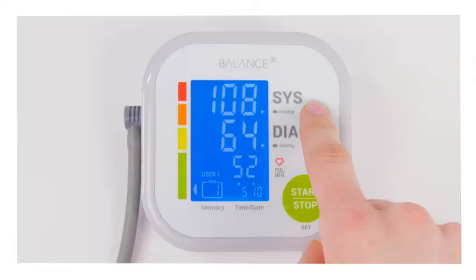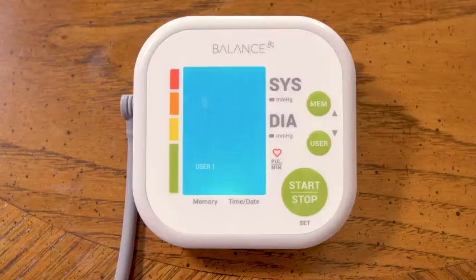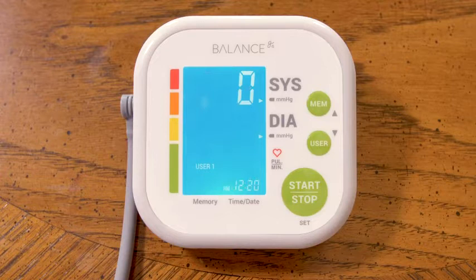I'm going to hit the start button and it's going to ask you which user you are. You can have two different users for each unit, and it can actually save up to 60 entries inside the unit itself. I'll hit the start button again and it's going to start taking my blood pressure.